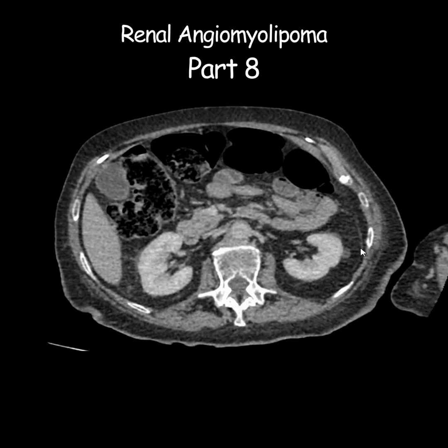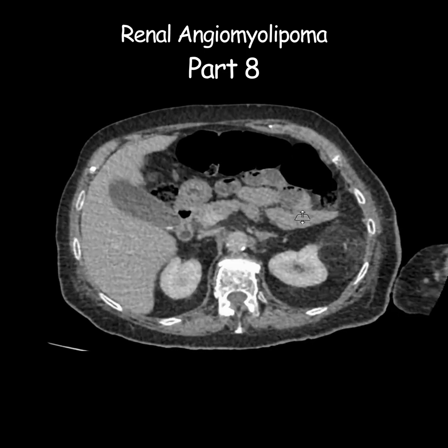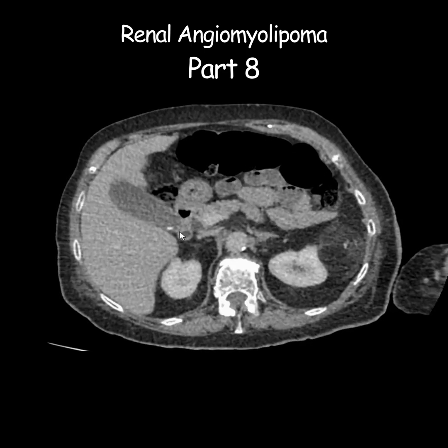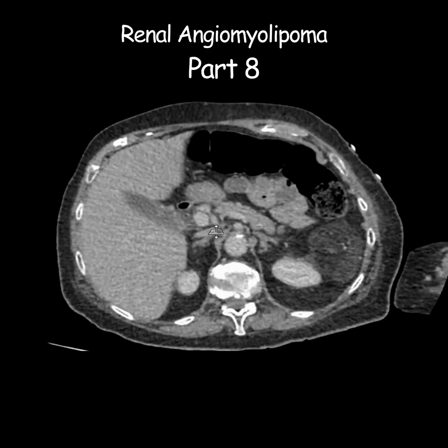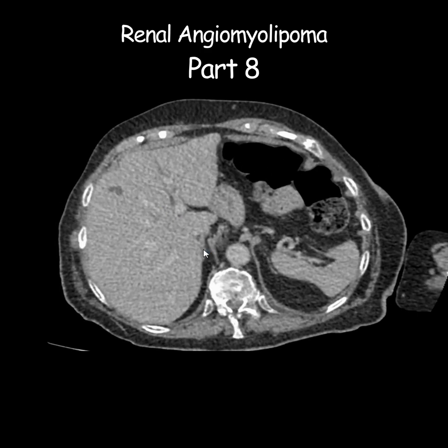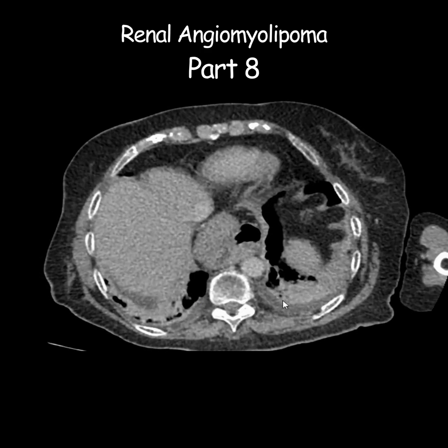Are there any important findings on this imaging? I'll just take a look at the upper abdomen — I'm not going to look at the whole scan. You can see a few tiny gallstones, but there are no features of acute cholecystitis. It looks like there are some hepatic cysts — tiny cysts — and they look benign. And then we saw a small amount of pleural effusions with some overlying lung atelectasis.